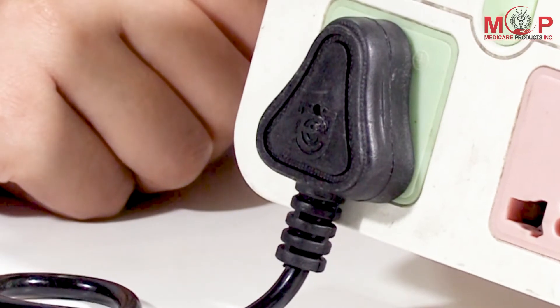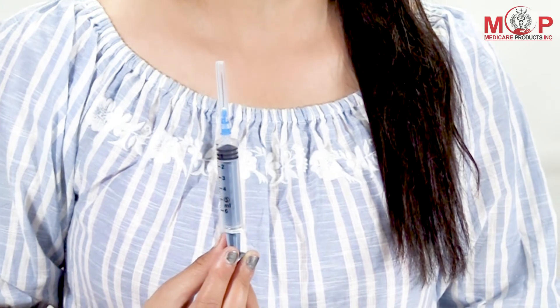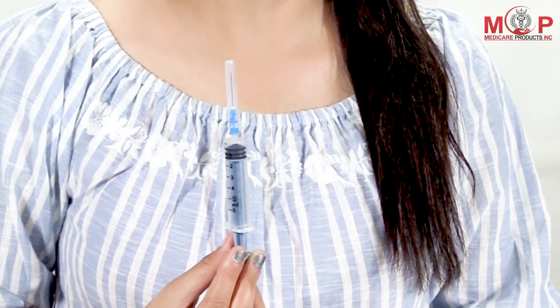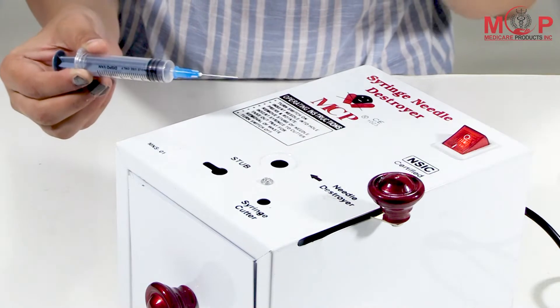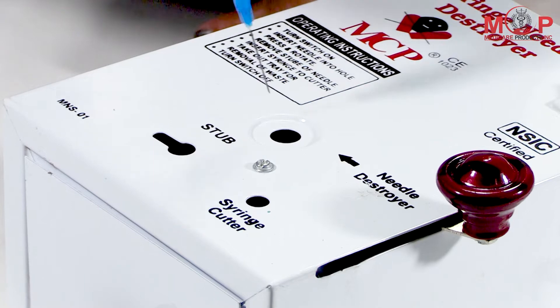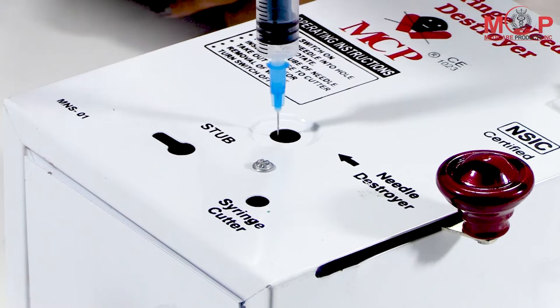To terminate the needle, switch on the device and insert the needle in the needle slot. This model has a main circuit breaker fuse and works on very low power. Push it gently downward till the sparking stops completely.